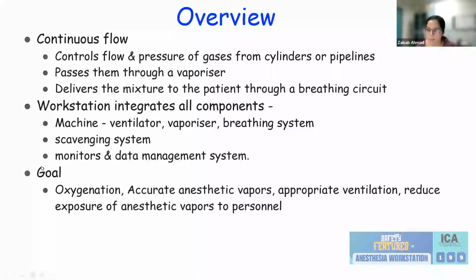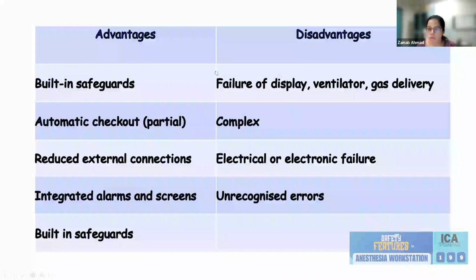It helps a lot in meeting the goals of the patient, that is ensuring oxygenation, ensuring accurate delivery of anesthetic vapors, appropriate ventilation, and reduction of exposure to the personnel inside the operation theaters.